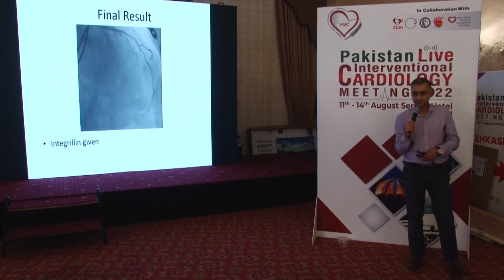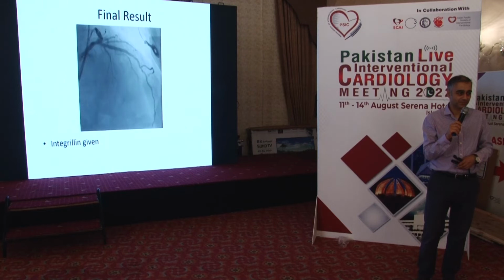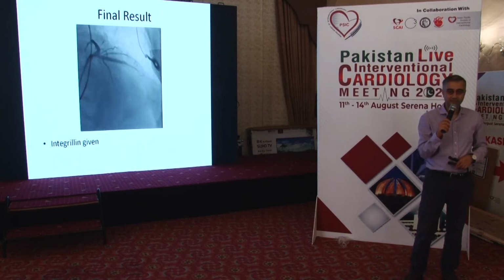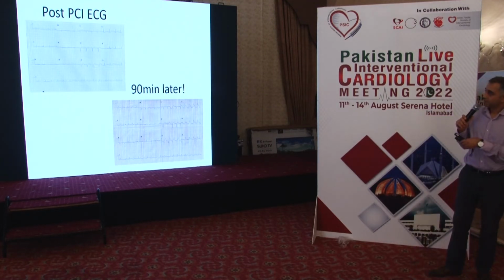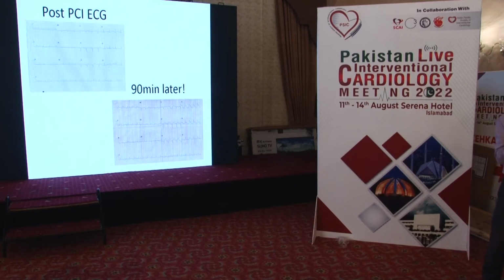I gave some integrilin, ReoPro, yeah, and he went back to the coronary care unit. So I was quite happy. His STs had come down, his chest pain had settled at this stage. Next slide. Okay, so post-PCI, STs are down. 90 minutes later, my fellow rings me up. He's got chest pain again.